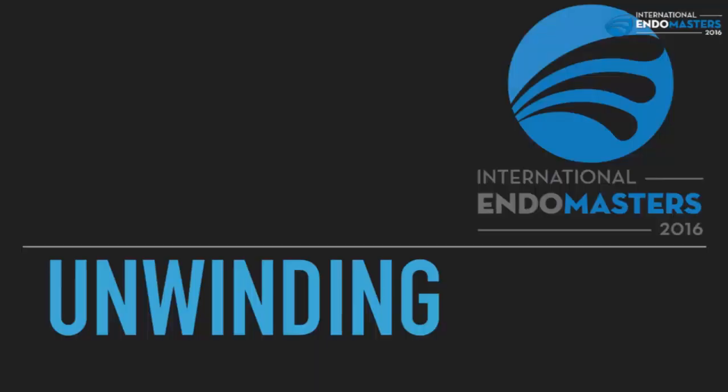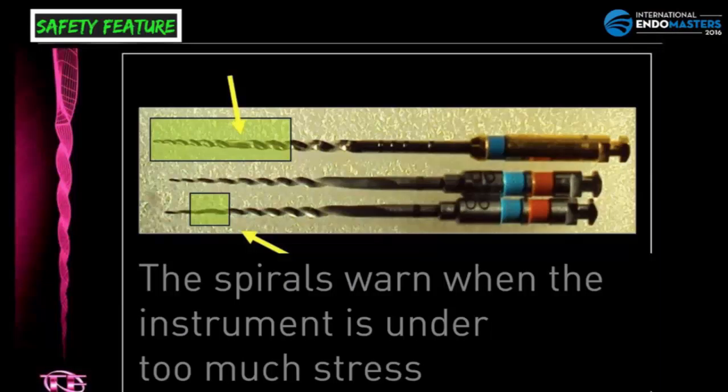The second problem is the unwinding. The spirals unwind when the instrument is under too much pressure, especially in the D3 and D4 of its working length.